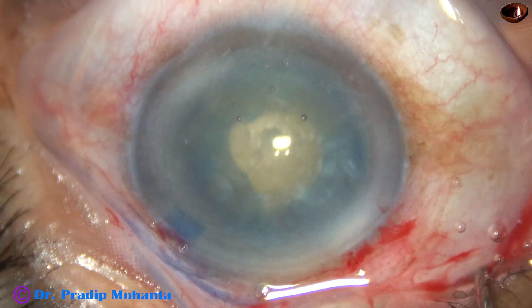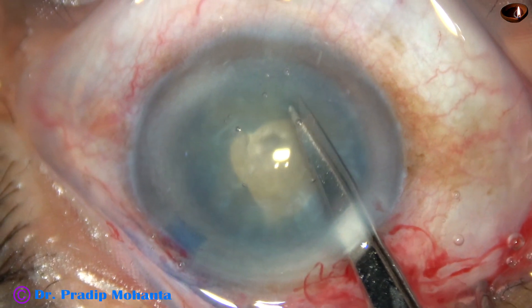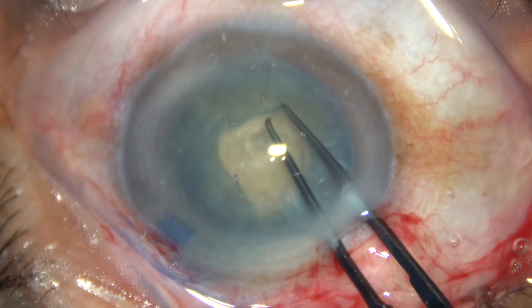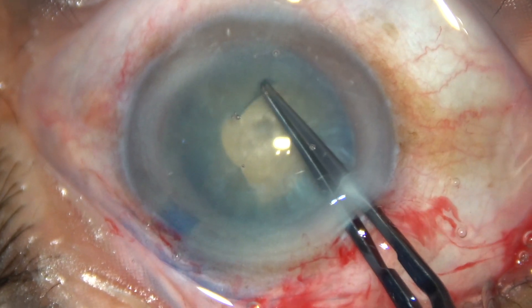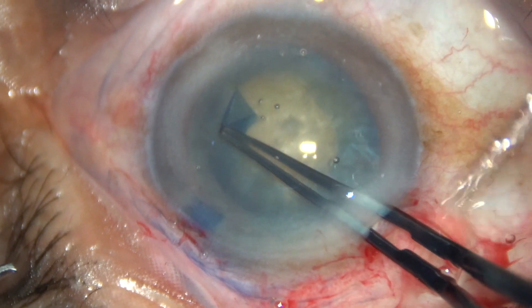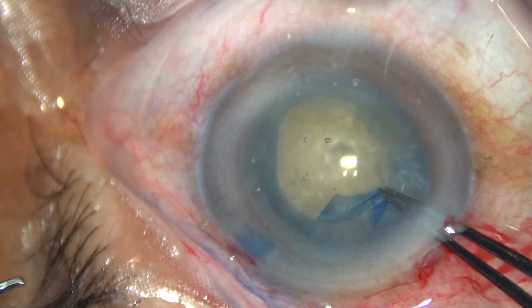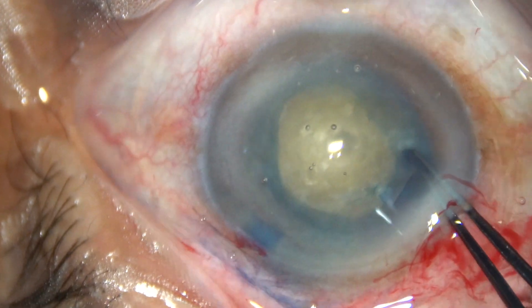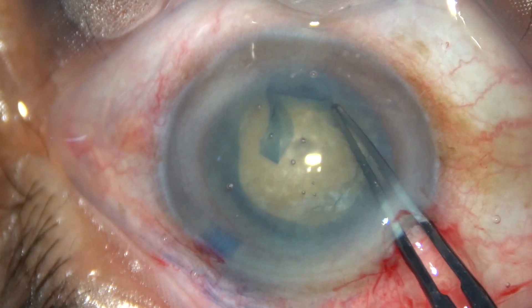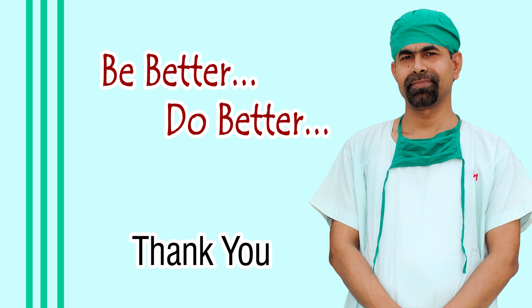This cataract will no longer behave like an intumescent cataract — the lens capsule will not tend to run to the periphery. Again, an oblique cut with a Vannas scissor introduced through the 2.8 mm main wound, and capsulorrhexis forceps are used to convert this mini-rexis into an optimum-sized rexis. This procedure has been described by many authors, but they advise use of sodium hyaluronate. In my technique, I never use sodium hyaluronate — hydroxypropyl methyl cellulose is good enough.